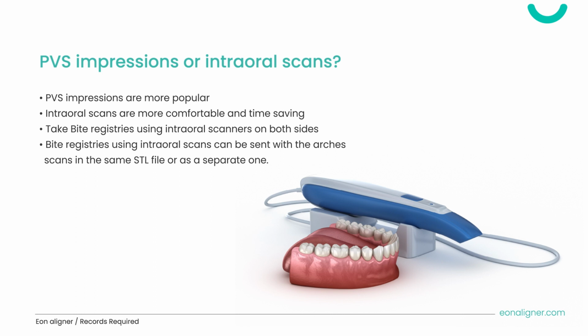Scans are directly uploaded to Eon Access or sent through a third-party integration system. The risk of having a defective scan is also less than impressions, which will decrease the chances for retakes. Bite registration using intraoral scanners should be taken on both sides to avoid any errors, and it can be sent with the scan in the same STL file or as a separate one, depending on the scanner being used.